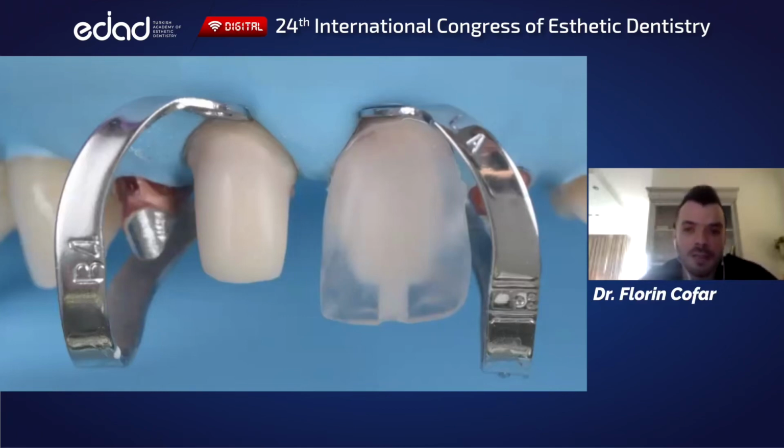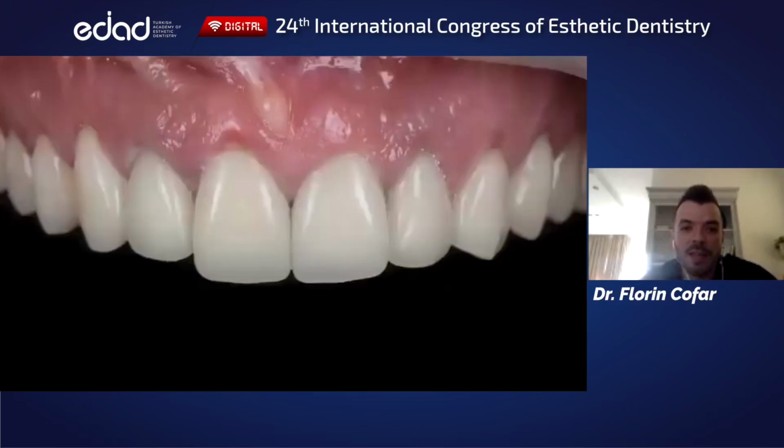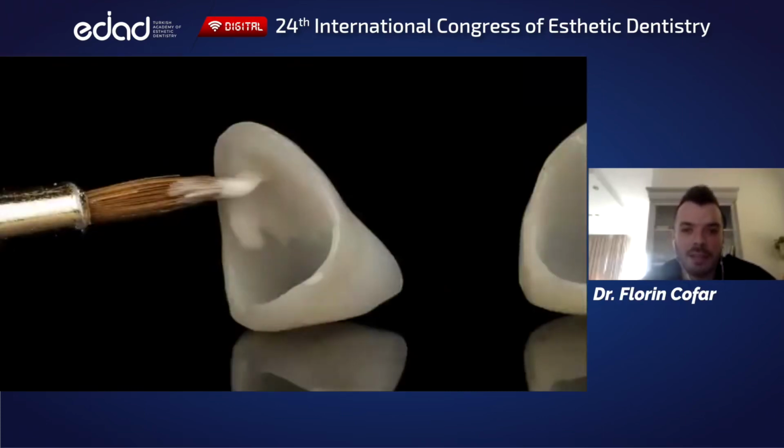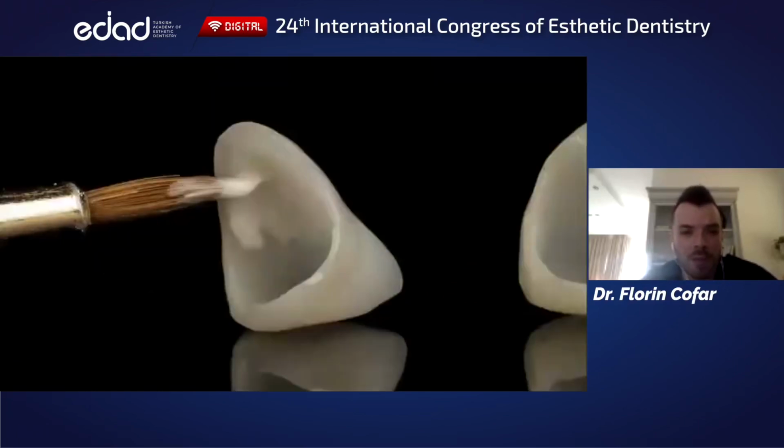Now you can see in the laterals, we still have some dark areas, and we still have some dark areas in the tissue because we opted for preserving ferrule. This we will manage with staining inside the restoration. You can see those areas, that cervical millimeter, you can put some inside stain. In this picture, you have an exaggeration of how much stain you should use, again for didactic reasons. In reality, you have to put very little. That's the thing about staining, it has to be subtle.